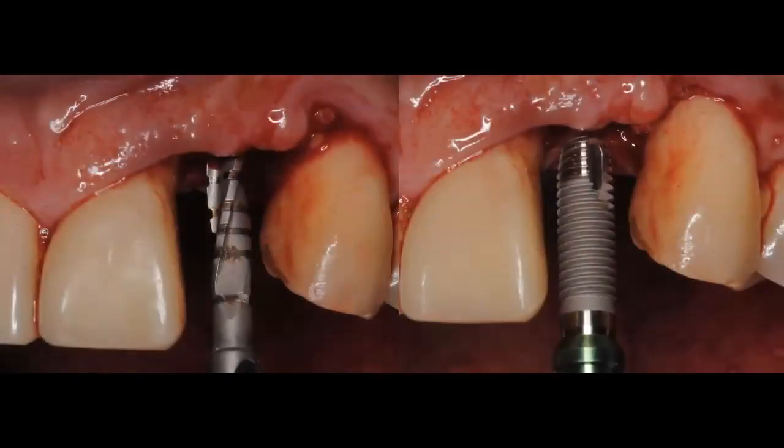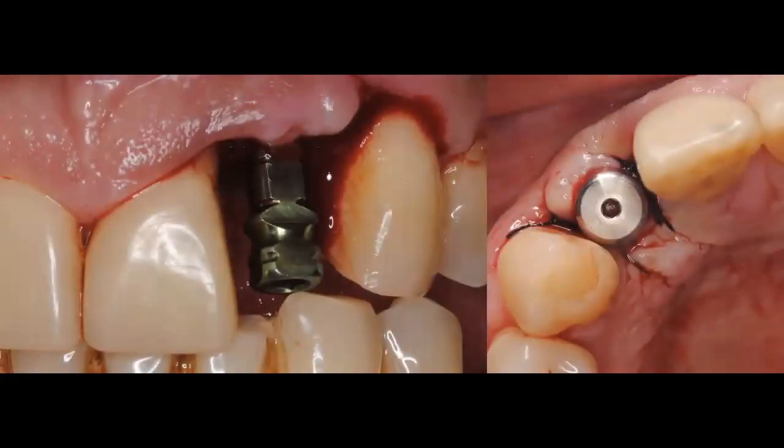So you can see here, now that I have assured myself that I'm in the right location, I'm going to keep my hand steady and continue with my osteotomy and then finally deliver the implant in that implant site. In this particular case, I used a Zimmer implant, and you can see that I've placed the Zimmer implant and the implant carrier, the flat surface is placed towards the buccal. And this is just to keep an orientation.